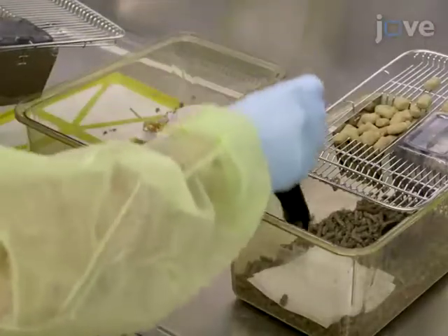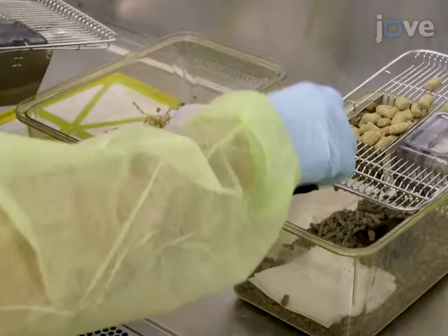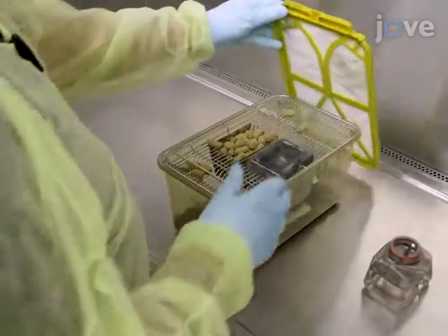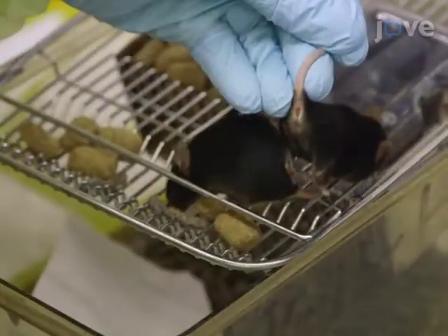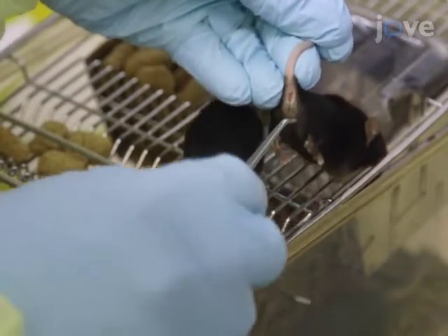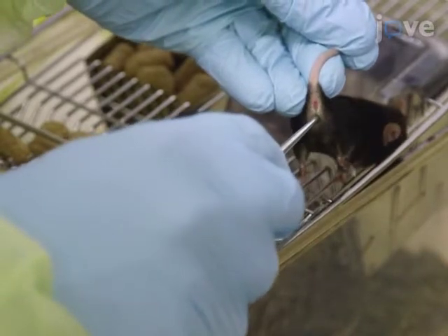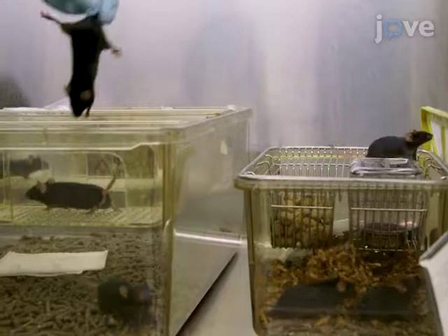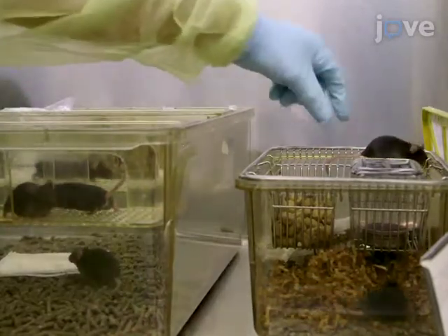For breeding, combine one sire and two potential dams in normal cages. Every morning, check for vaginal plugs, which indicate that the animal has mated during the night. If a plug is not seen, resistance to vaginal probing can detect an internalized plug. If a female has a vaginal plug, transfer her to a large pup rearing cage.